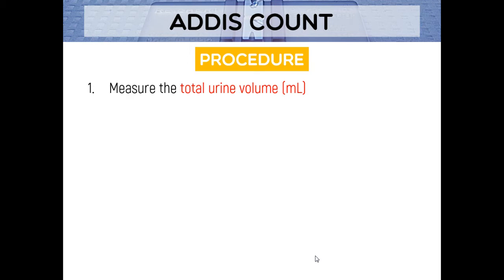And if na-perform niyo siya in real life sa lab, ako personally, akong gigamit sa una kay katong 6 liters na absolute. Ina nakadagan akong ihi, yes. Kay 24-hour urine specimen to siya. So sadya ang pag-collect. And you have to measure all good. So mabot to mga 700 ml, mga nana, di ba? Yeah, mga nana or mga 1 liter jud ang ihi. So yeah, sadya siya. Okay, so again, first procedure, measure the total urine volume.